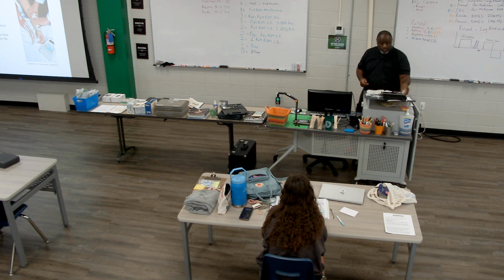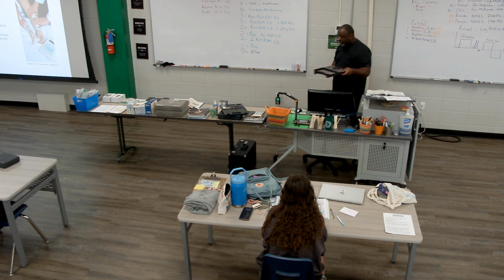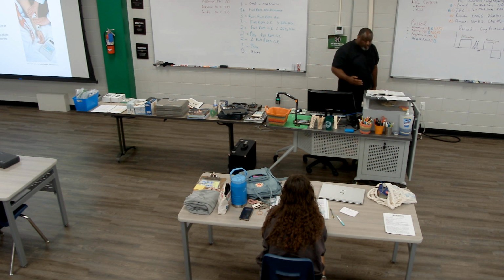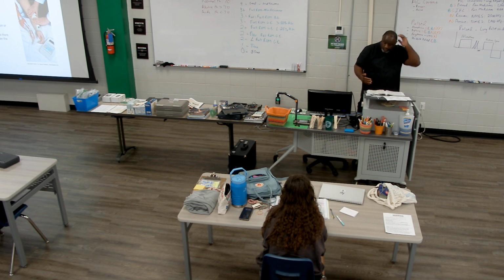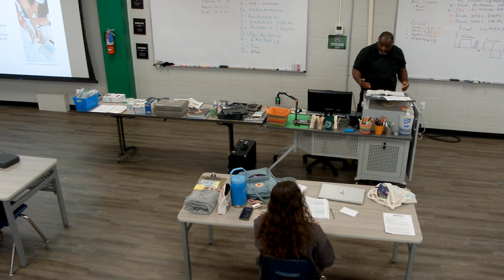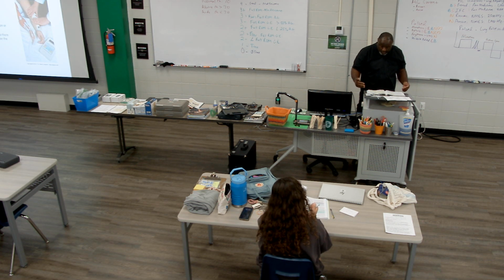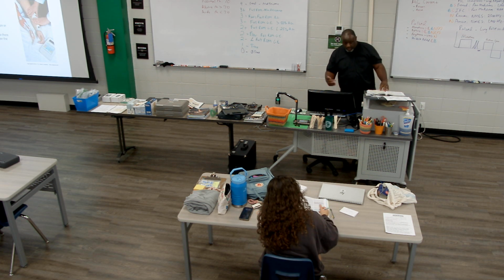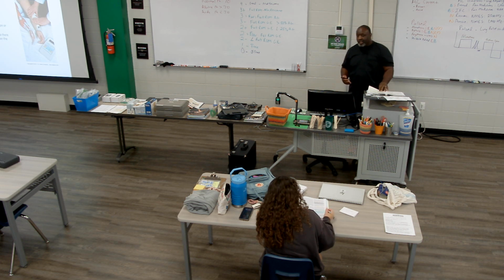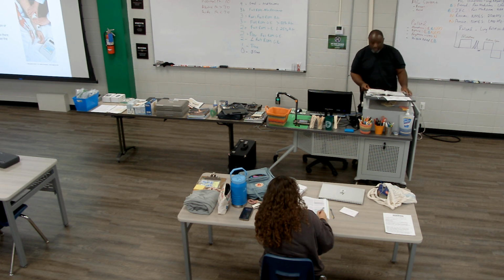So how does this work? Let's jump down here, talk a little bit about it. It says hair follicles and sweat glands make up about 0.1% of surface area of the body and represent pores in the skin where things can enter. So where charge can be concentrated or things can enter the body. So 0.1% of the skin doesn't sound like a lot, but when you consider all of the skin, it is a pretty good amount.